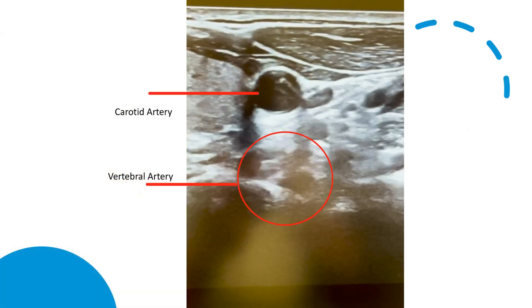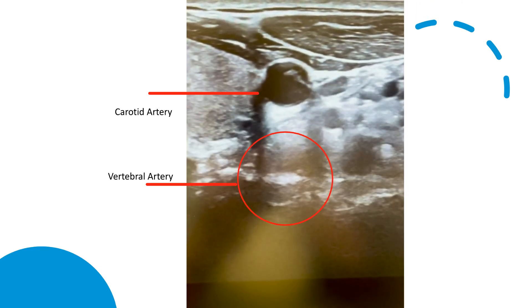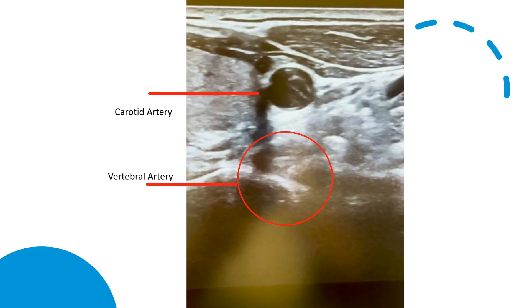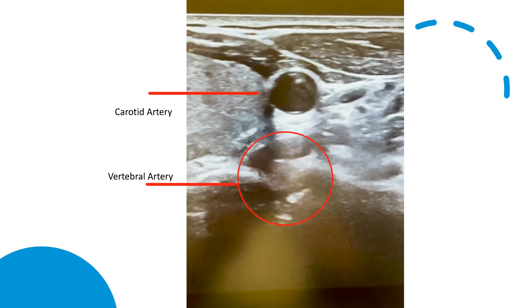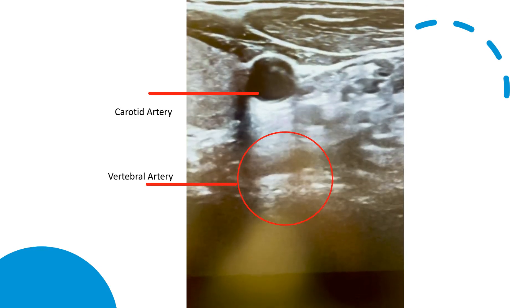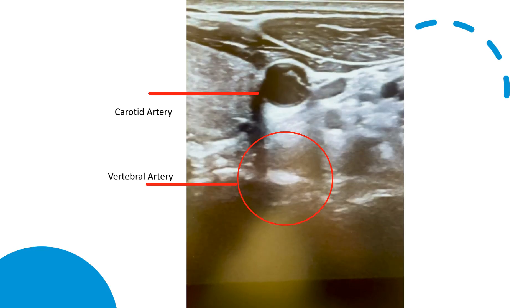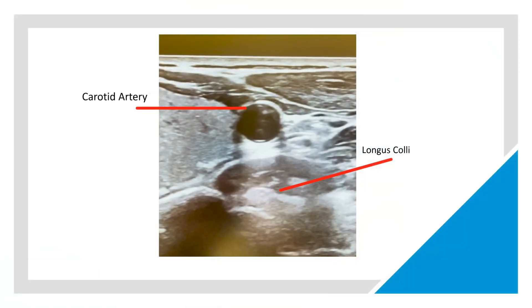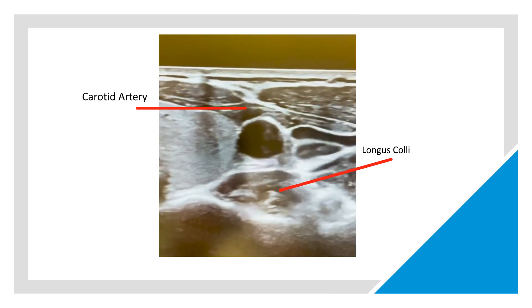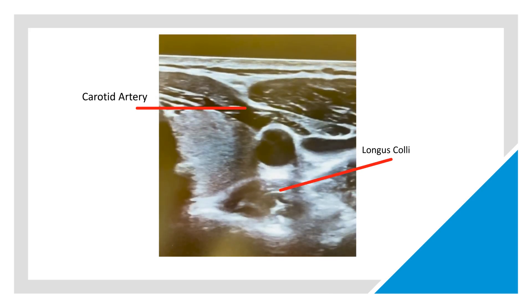Starting at the clavicle, identify the carotid artery and internal jugular vein with the vertebral artery deep to the major vessels. We begin scanning cephalad, paying attention to the presence of the vertebral artery. With the vertebral artery in view, we continue to scan cephalad until the artery disappears under the hyperechoic shadow of the transverse process of C6 and the body of the longus coli.